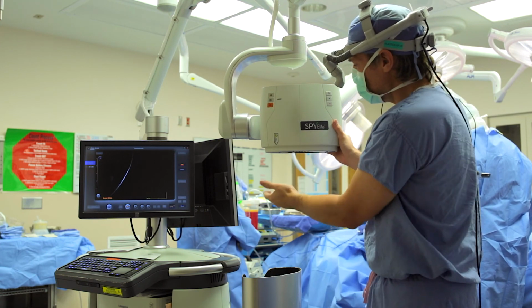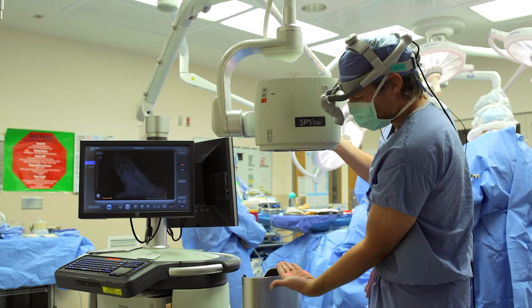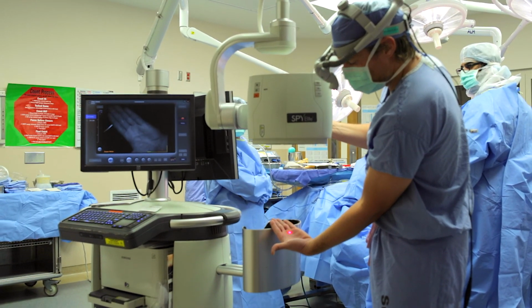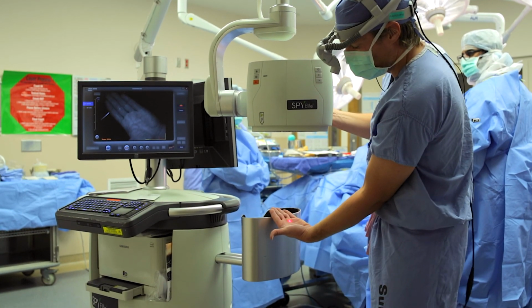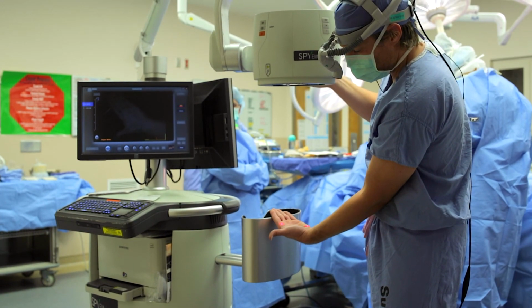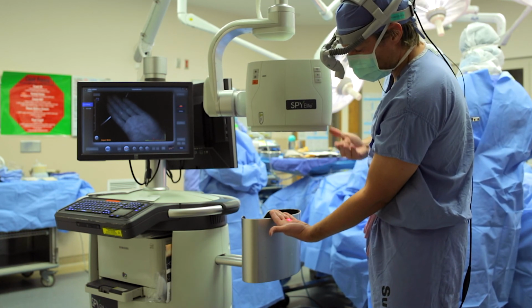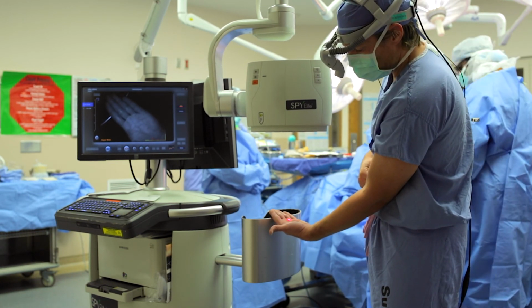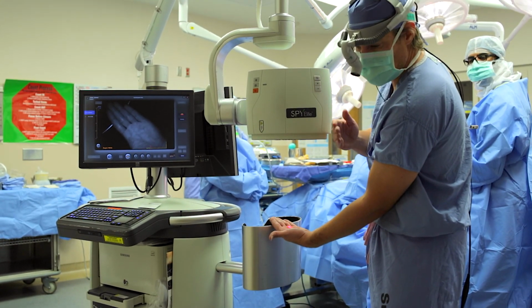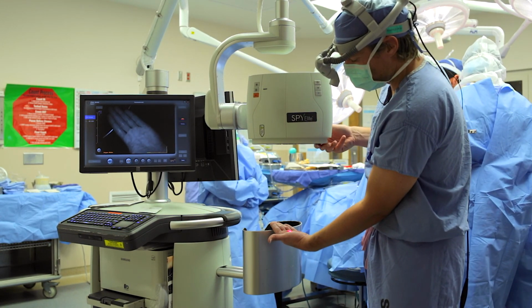This top button is a laser crosshairs. Now this is not the laser itself, but this is just measuring focal length, and so that you have a standard length of which you're taking the image from, because how far you are away from the target is going to matter how bright you see the images. So that you have a standard image, you just bring those crosshair lasers into one beam, and then you know that at the measurement of whatever you're trying to measure, whether it be skin, muscle, an organ, small bowel, colon, whatever it is, you know that you're at a standard length, so that over time you're able to gain meaningful information from the numbers that you're obtaining, okay?